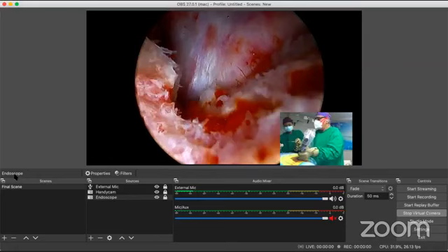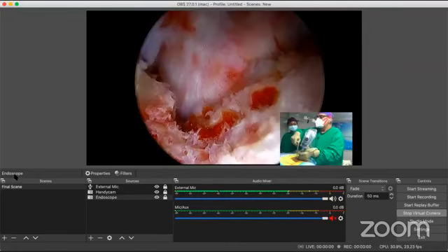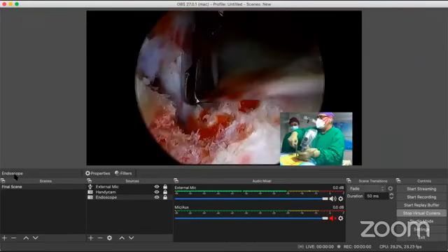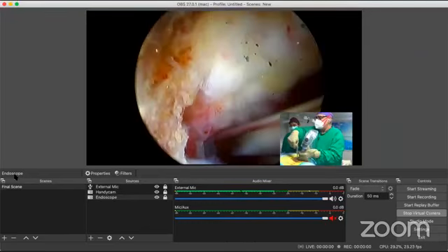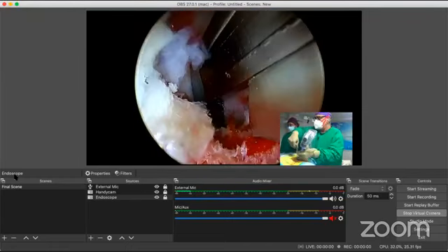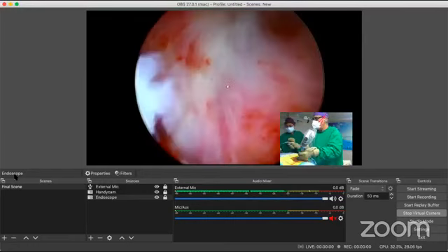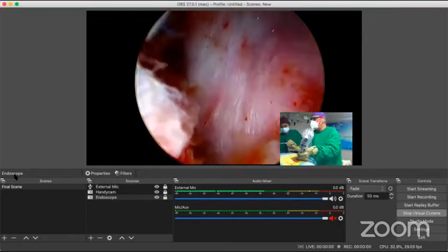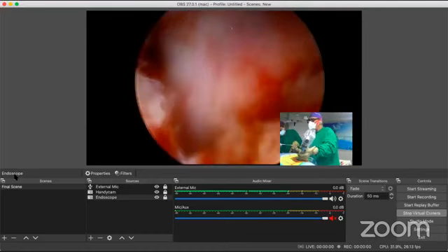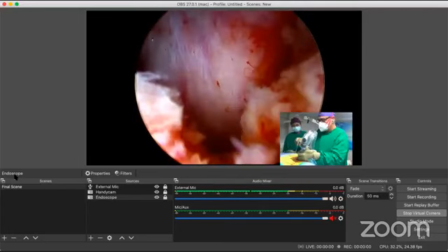You can see how tight the nerve root is. I have not stripped the outer membrane. I'm trying to remain outside the membrane continuously. And you can see how nicely we are opening up the nerve root. You can see the flow of the nerve root. You can see the pedicle also coming up. This is the pedicular wall on one side, and there's a pedicular wall below.